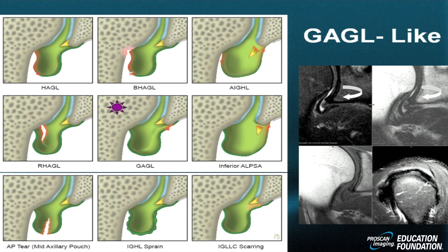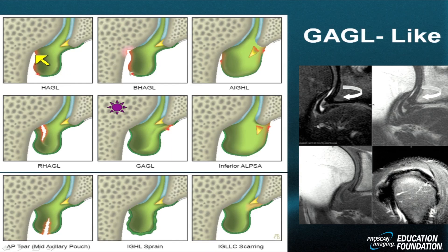We're going to cover both anterior and inferior syndromes. As a quick review, we have the HAGL lesion — the humeral avulsion of the glenohumeral ligament. Here is the inferior glenohumeral ligament, and there is the injury in orange from the humeral neck — the humeral avulsion.